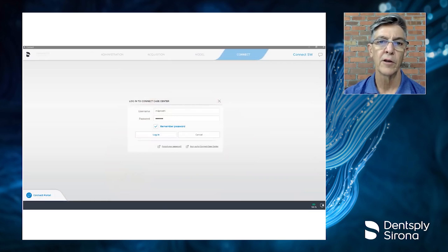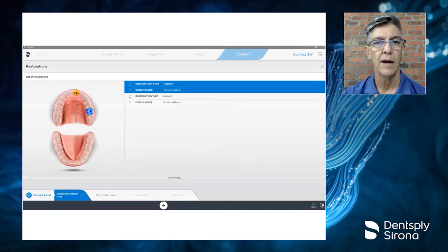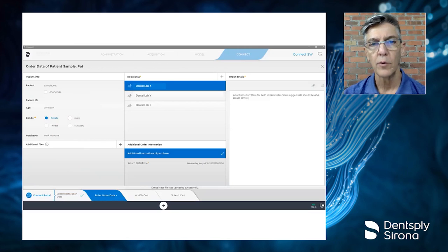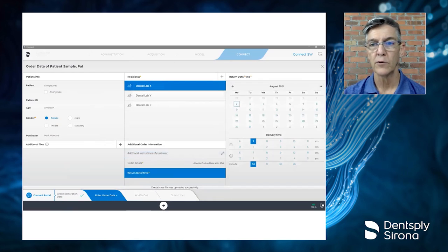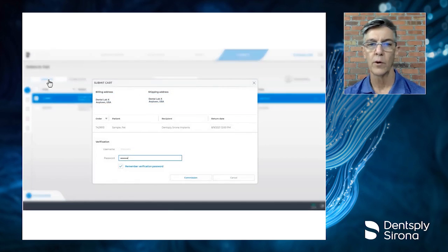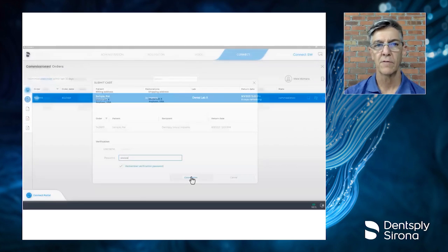So once done, I'm going to now log in and I'm going to order what I want. So I'm going to basically send this to the laboratory and telling them what I want to do. And there's some basic data you need to enter. In the gender box, we will choose one of the four. In the recipient, we choose who we want to receive this information. And we will type in whatever information we feel is appropriate. So in this case, I'm saying Atlantis CustomBase and consider angled screw access. We give a return date, and then we click submit our cart. And then once that's done, we commission it, and it's off and running.